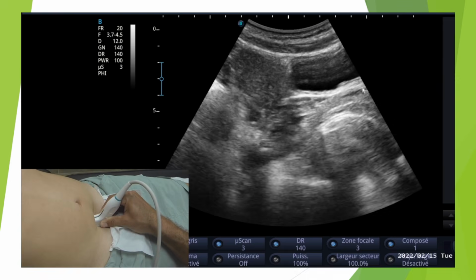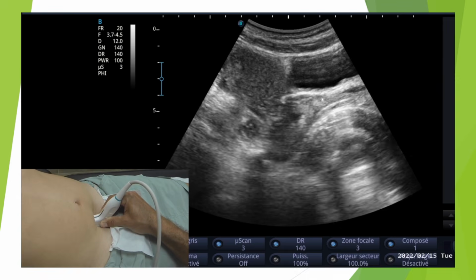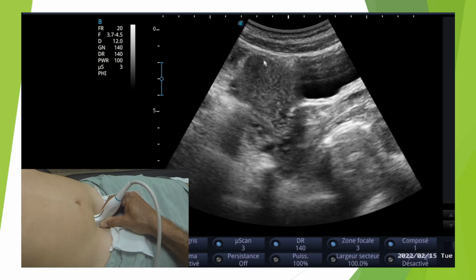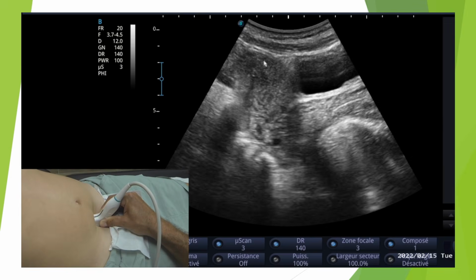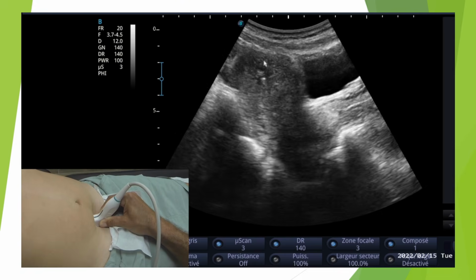And so what we're going to do is try to identify. We're going to try to spot here in our uterus a hyperechoic image with a posterior shadow cone. On the more recent models, you can actually see the hyperechoic image quite well. On the older models, you might only be able to see the shadow cone. We're going to do this together.